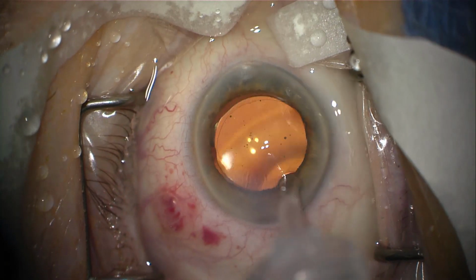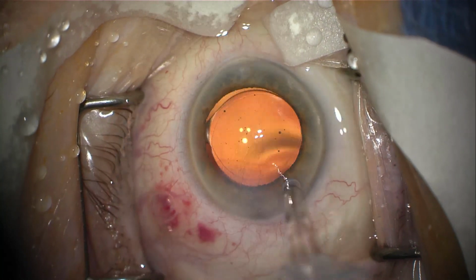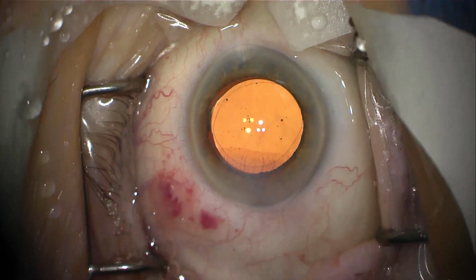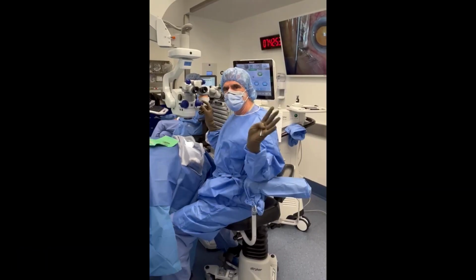What I'm doing now is just irrigating some antibiotic and steroid solution on the eye to prevent infection and reduce inflammation. I'm now squirting some more of the numbing drops, and now what I'm going to do is remove that wire lid speculum that kept the patient's eyes open. I'm also going to remove these little plastic drapes from the patient, and we are done.